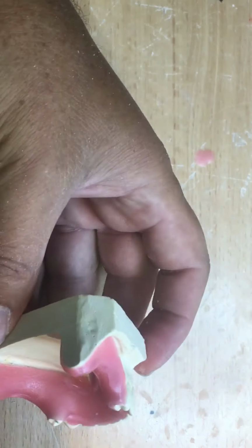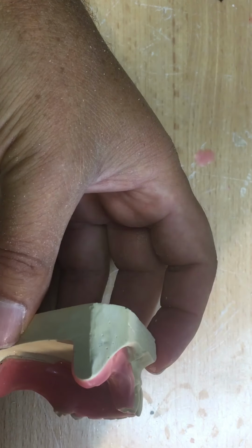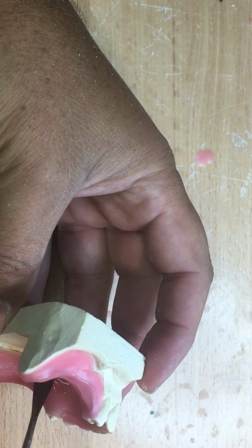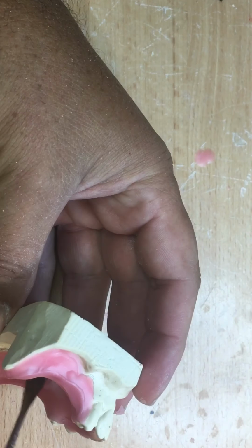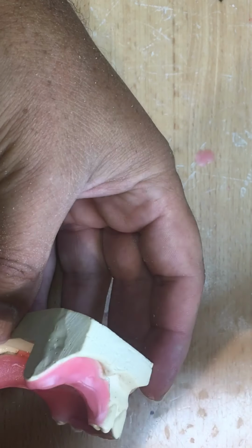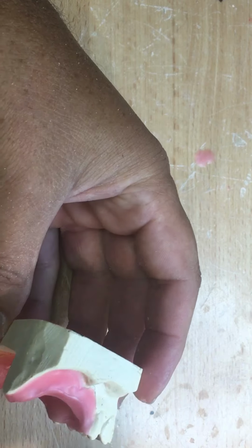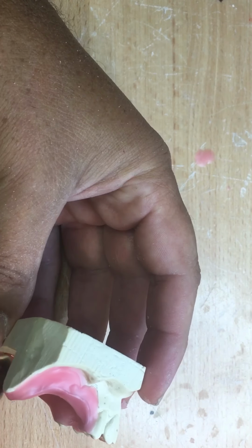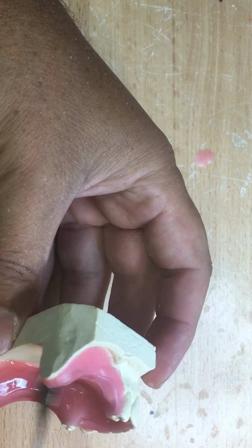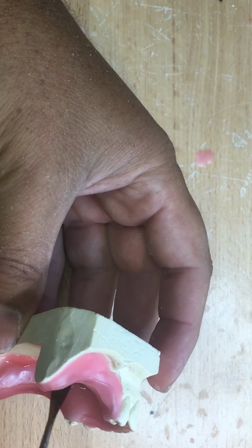Right? If you notice, most dental offices or most dentists will use the dental technician as a possessive word. This is my dental technician. Not this is the laboratory that I choose to create my products, or this is the company I deal with. They say, no, these are my dental technicians. So that speaks volumes in itself. But we'll leave that for another day. I'm just filling in the airwaves while I'm filling in the wax gap here.